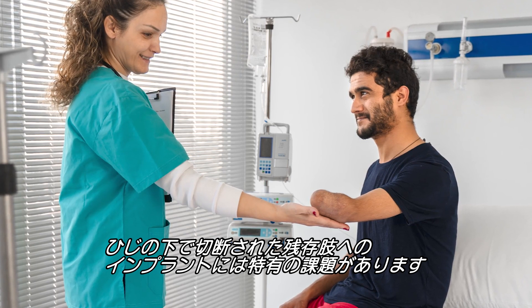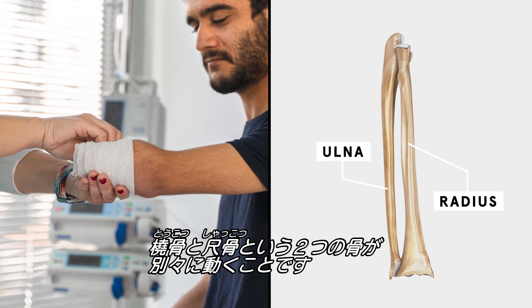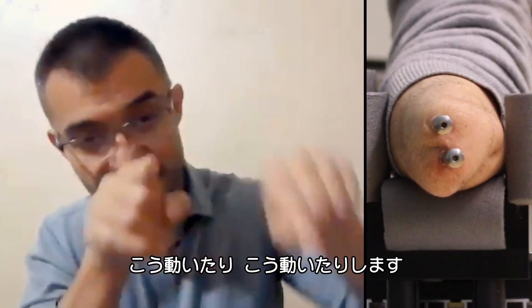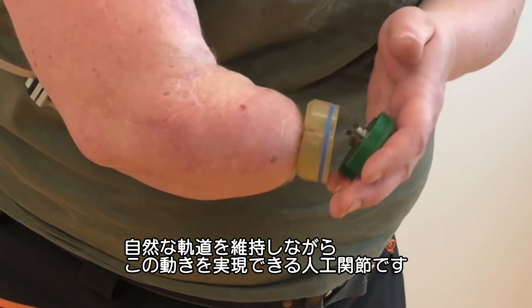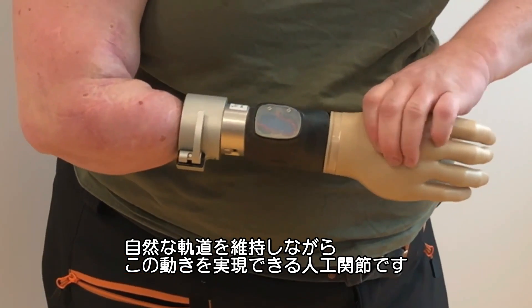Implanting into a residual limb amputated below the elbow has its own challenges, because there are two smaller bones — the radius and the ulna — which move independently from each other. They move in multiple axes and their own individual rotations. So the team developed an artificial joint that allows for those movements while preserving a natural orbit for the motion.